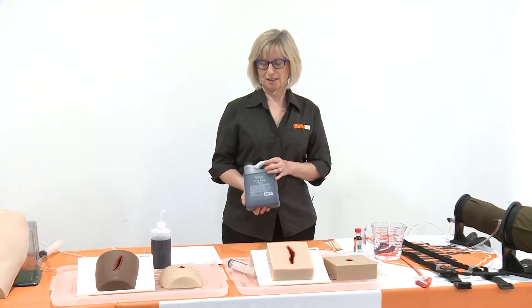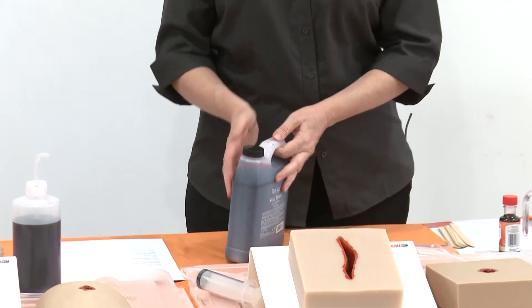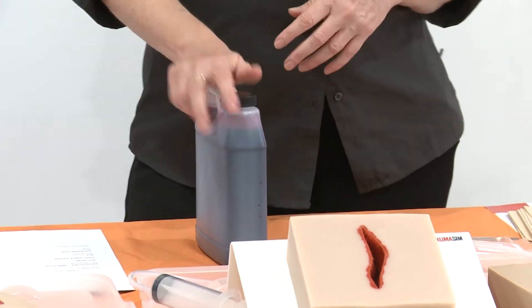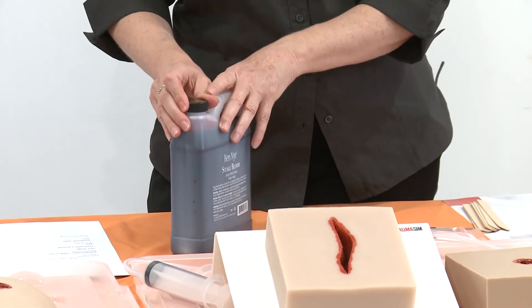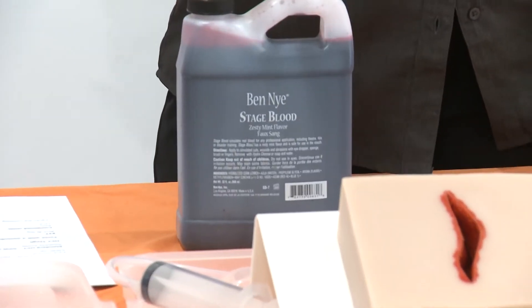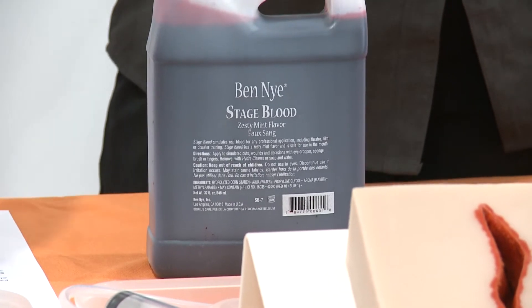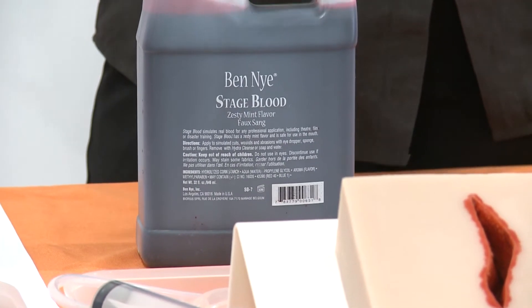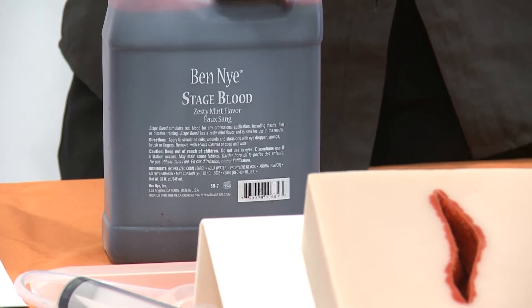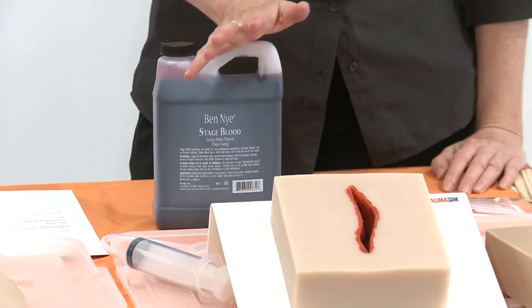We use a stage blood — it's a Ben Nye product, comes out of the USA. It's made to professional standards for Hollywood actor sort of stuff. It's not particularly expensive for what it is. The reason we use this one is that it's very safe and it washes out of everything — tablecloths, clothes, carpets — it's not too much of a drama.